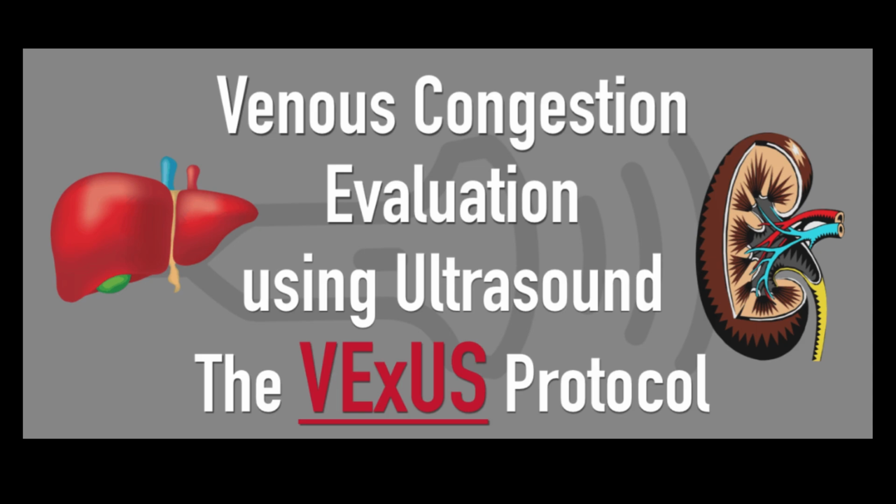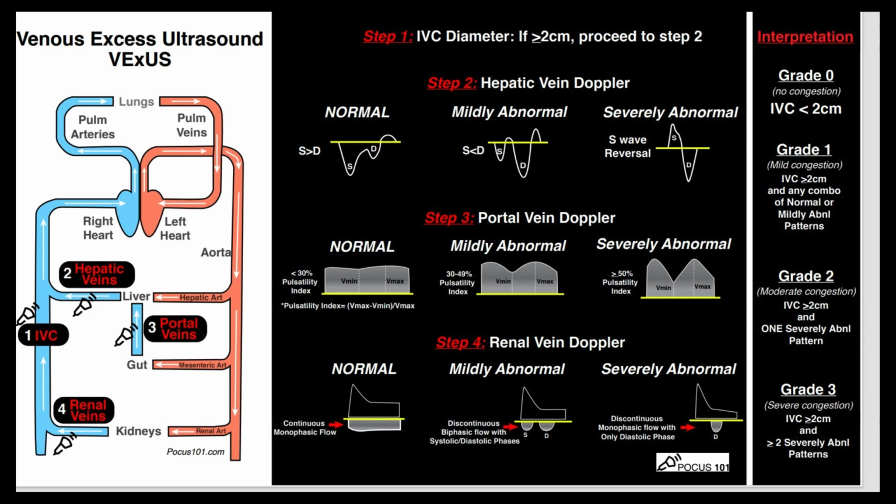So they came up with this protocol that has actually been validated, that if you use this protocol and you score even mildly, there's an increased incidence of renal dysfunction. So it is quite useful, but I'll show you what it looks like.